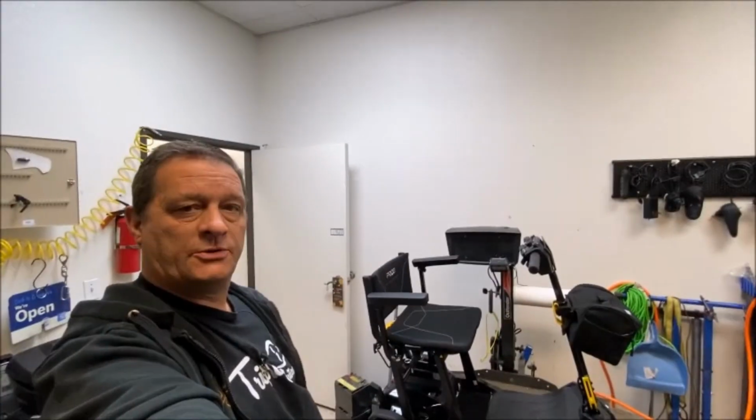Hey everybody, it's Ian at Las Vegas Scooters and Lifts, and today on my lift I've got something of the new kind. It's going to be a repair on a super portable.